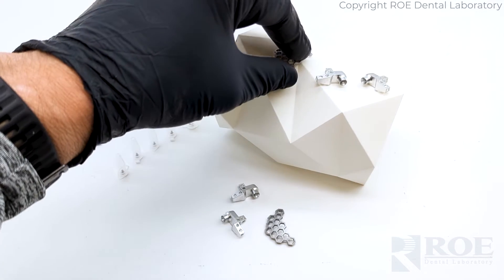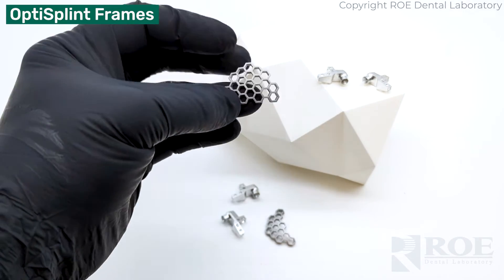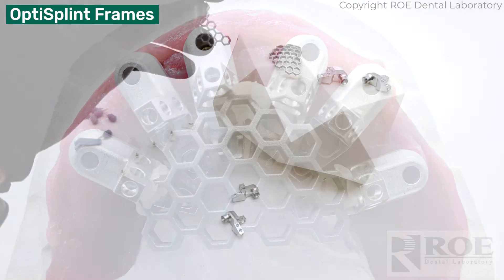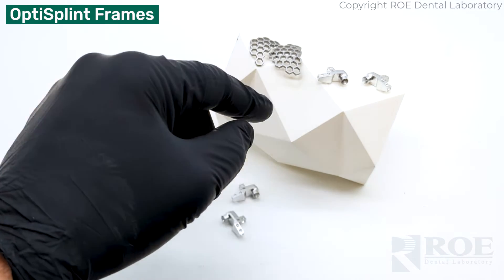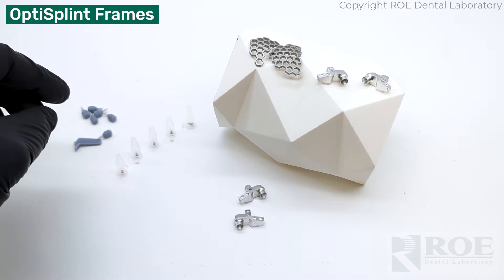The other components of the kit are the large frame and the smaller frame — large and small — used to lute the scan bodies together in the mouth, depending on the configuration of the horizontal wings and how they're connecting or contacting in the mouth.